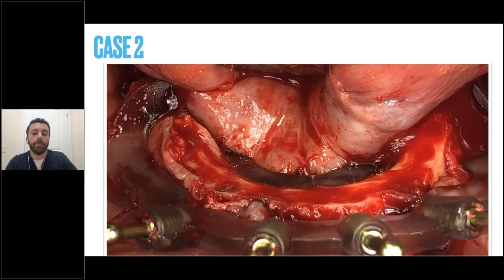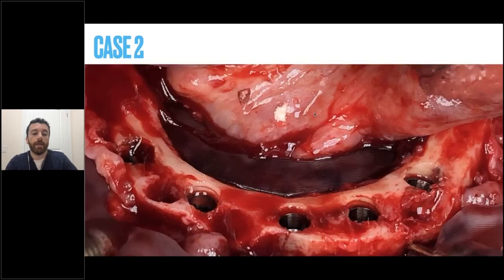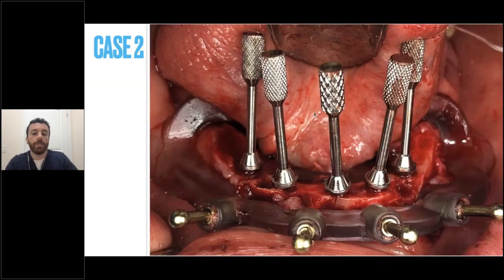So you can see here the bone reduction is performed next. Our osteotomy guide, implant placement, and placement of our multi-units. So these multi-units, like I mentioned, are facially tipping the prosthesis such that the teeth are now back in the correct position. The bone reduction that we have done has placed everything very lingual. So we need to have the multi-units bring everything back facially to line up in the correct spot.